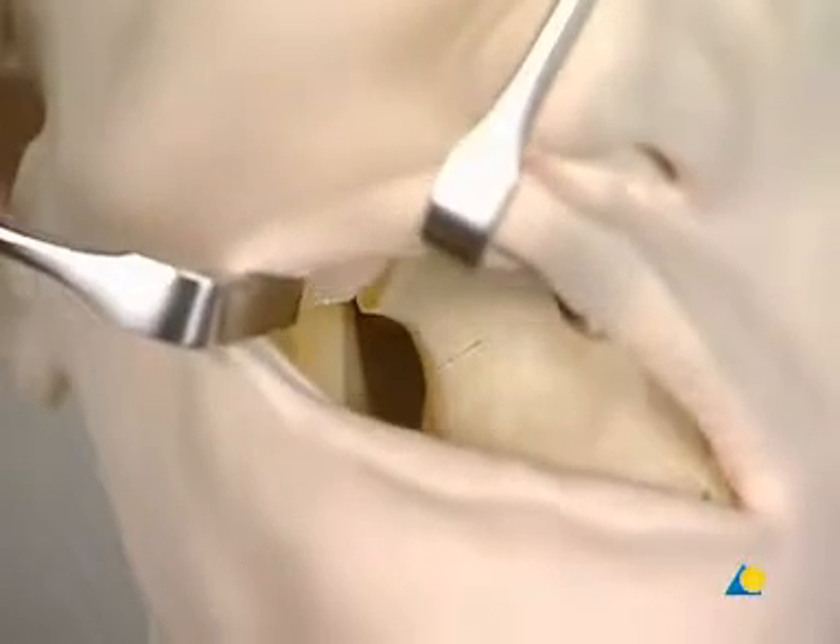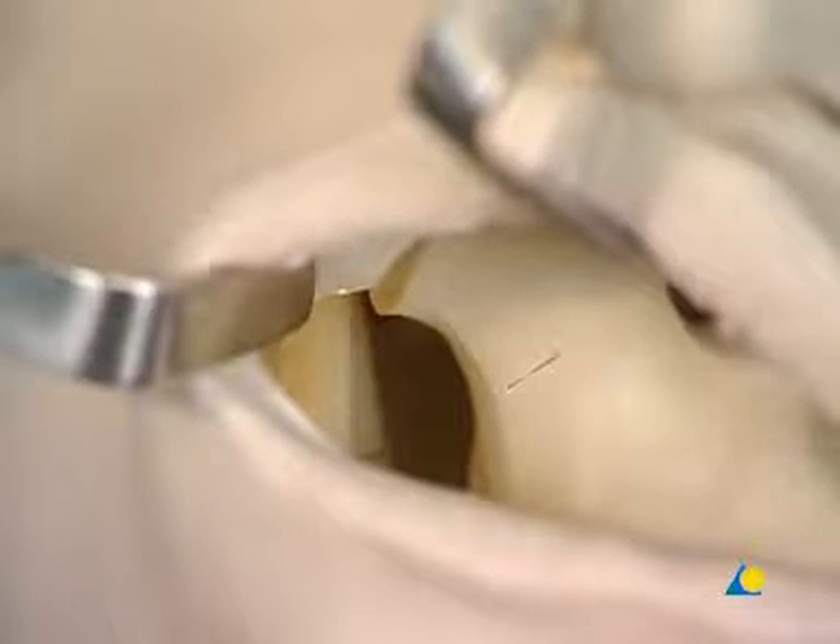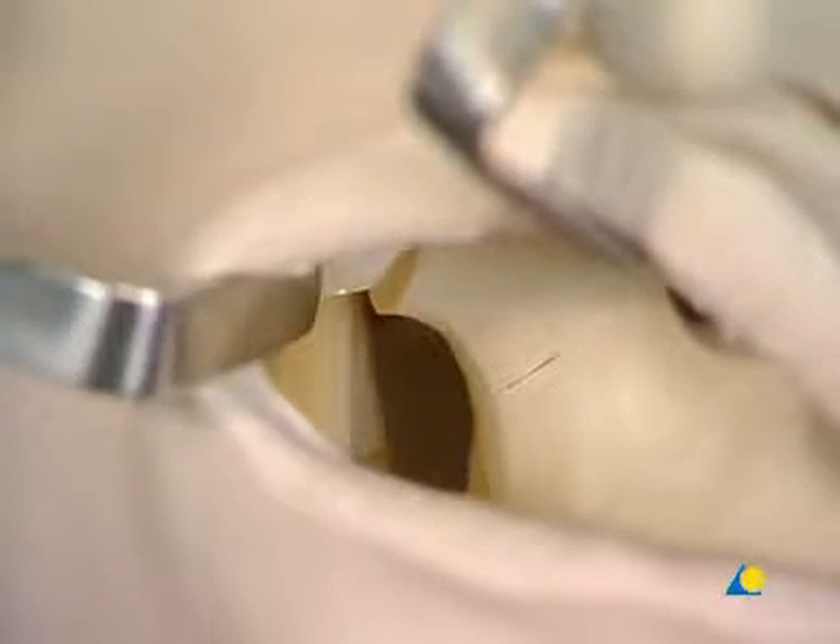Zygomatic maxillary complex and orbital floor fractures can be reached through either a lower eyelid or a transconjunctival incision and an upper eyelid incision. The fractures are exposed before reduction and fixation. The fracture at the lateral buttress of the zygoma can commonly be reached through an intraoral upper sulcus incision.